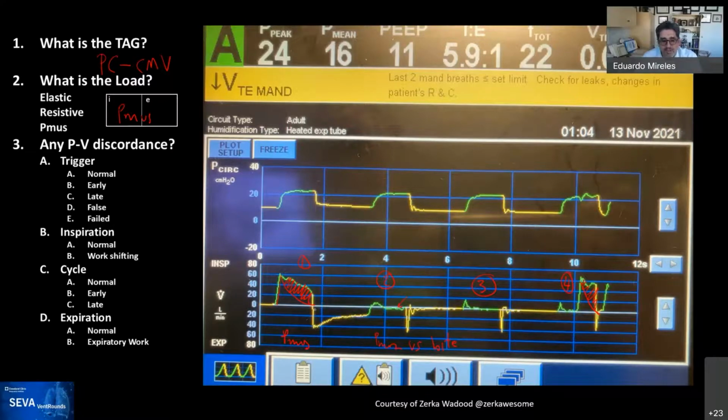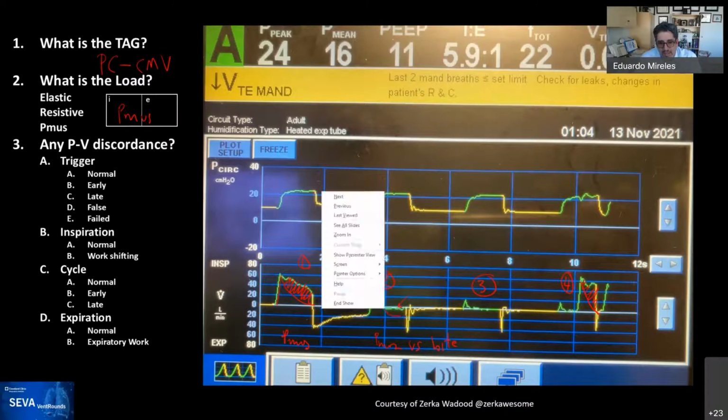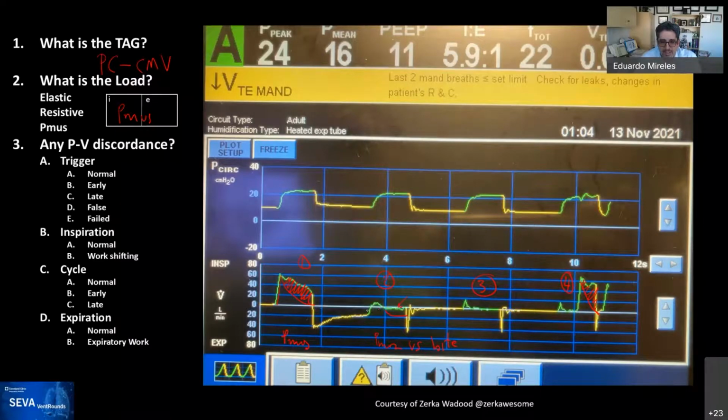I think that you're, so one of the challenges that I have with this, Rob, is that this ventilator does exactly what we described some time ago. I would expect the patient to be able to exhale during this period of time, right? If this is active exhalation, so that they get the breath, and then he would be able.